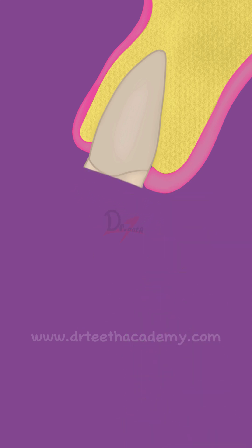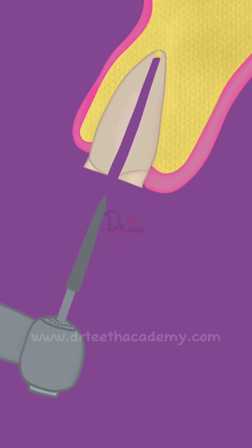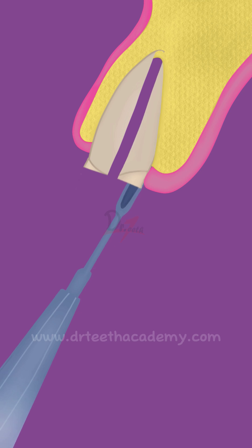After this, we'll measure the length of the tooth using CBCT or radiograph, and then we are going to split the tooth into the buccal half and the palatal half. We are going to remove the palatal portion of the tooth like so.